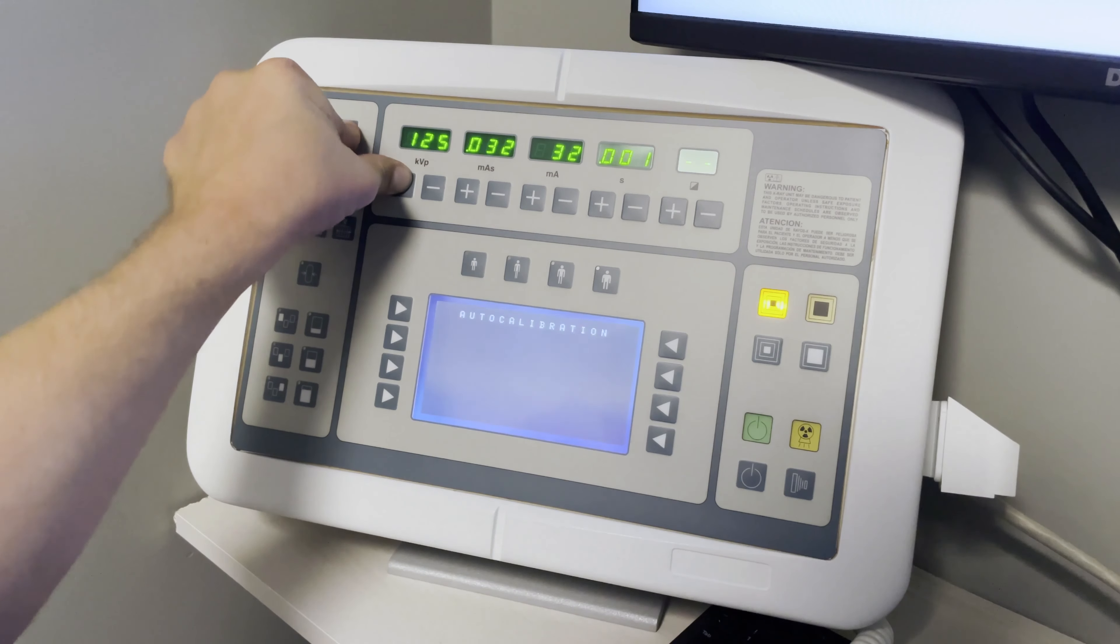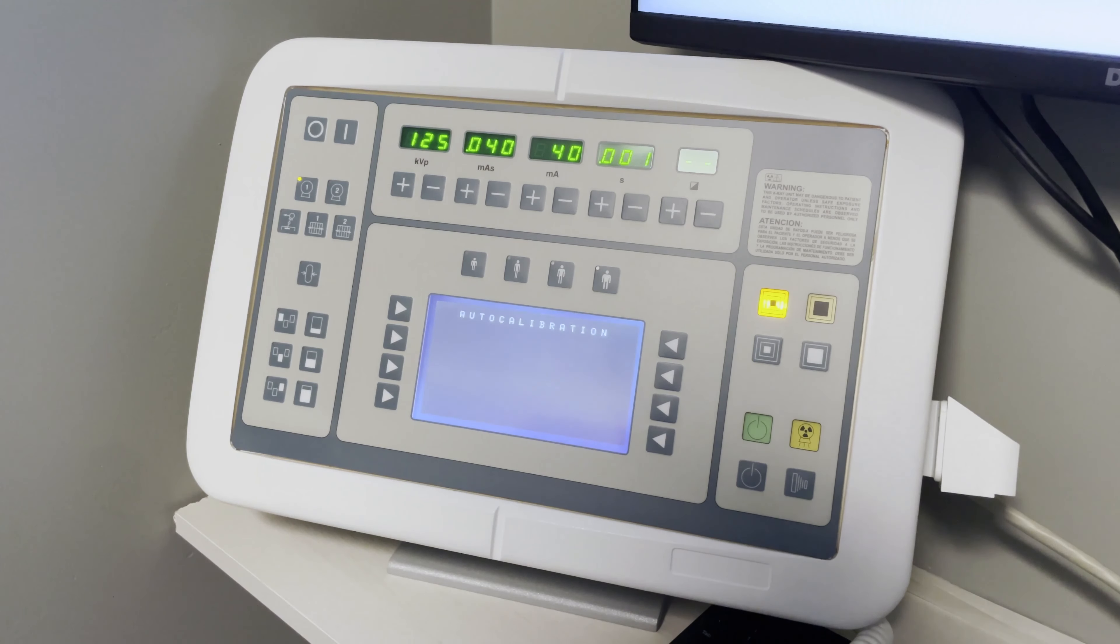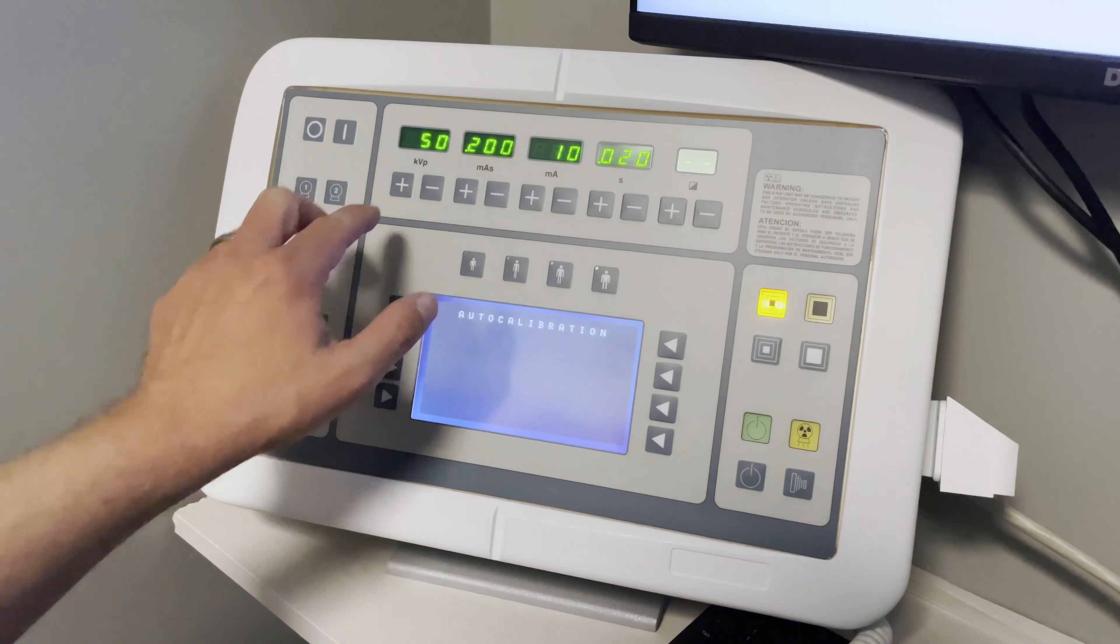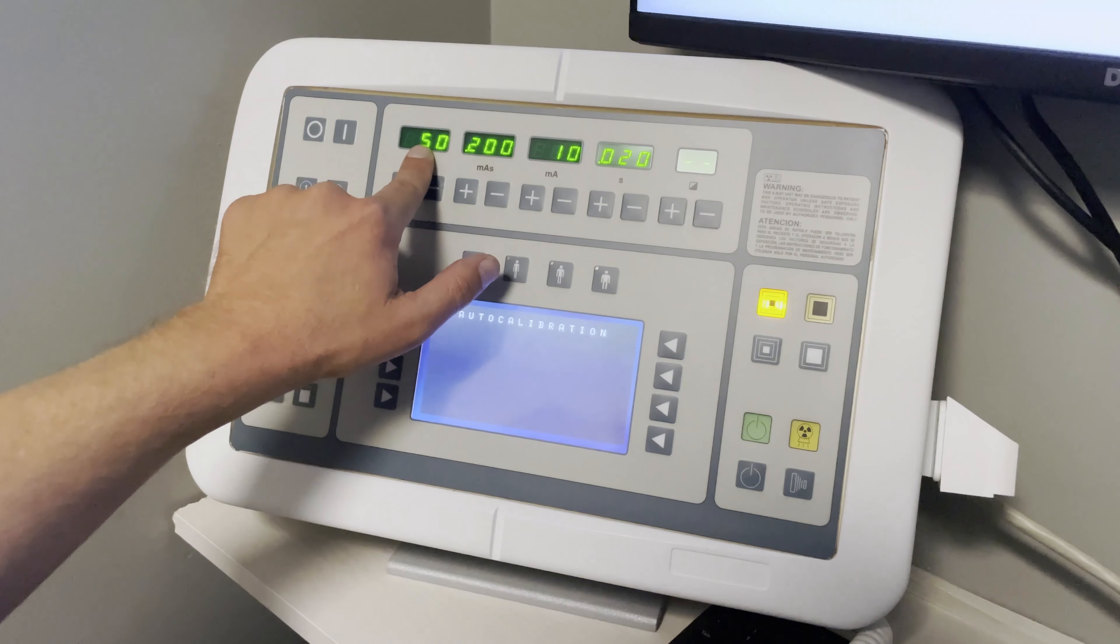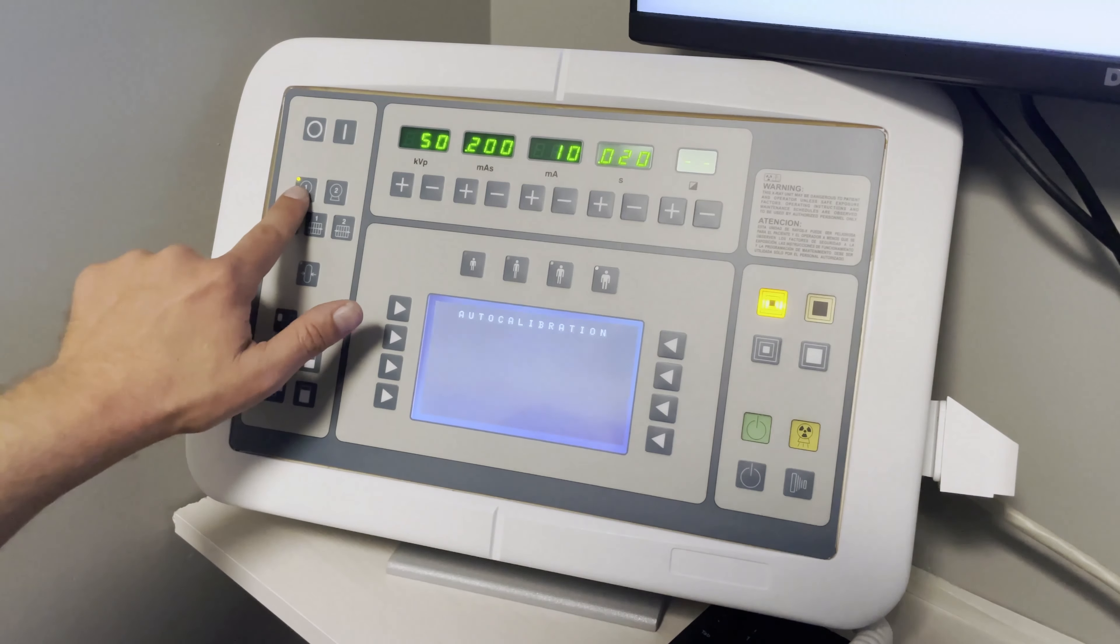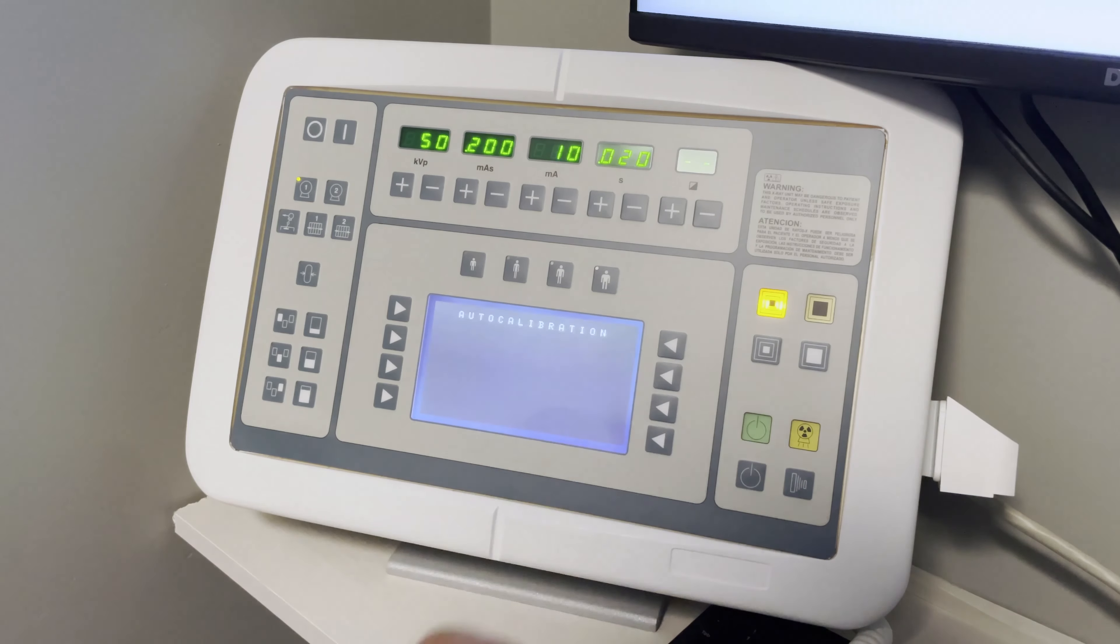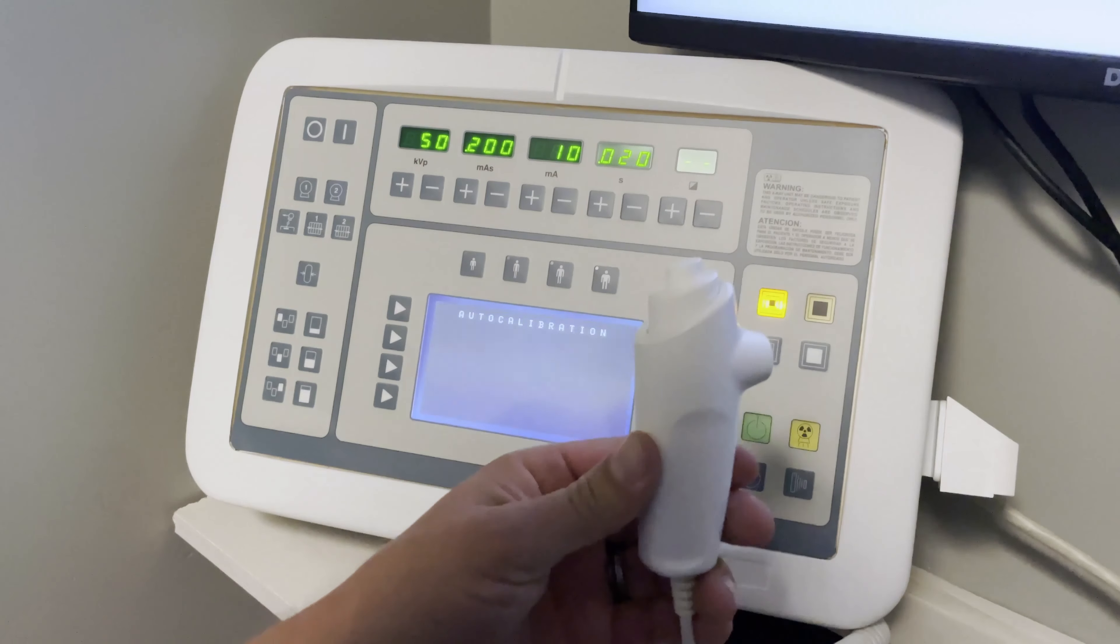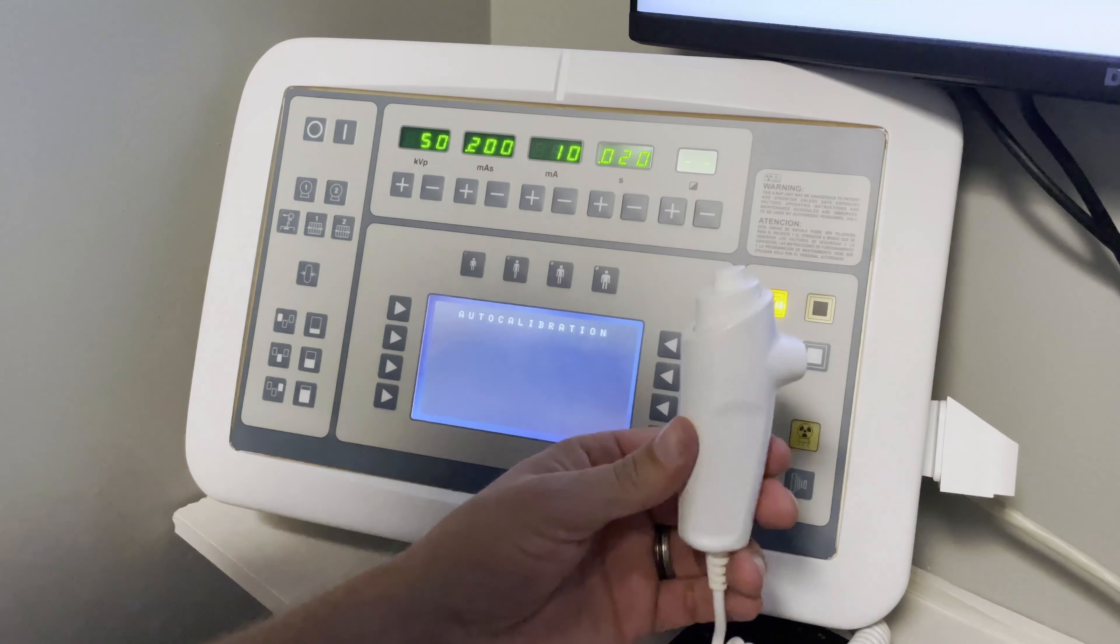Do it one more time. Now that I've hit it twice, you can see that the KVP is now at 50. The light is blinking and this is illuminated. So the next step that we want to do is we want to find the trigger switch, which is this button right here. And we're going to hold down on that and take a series of x-rays.